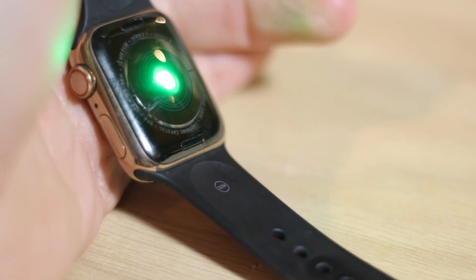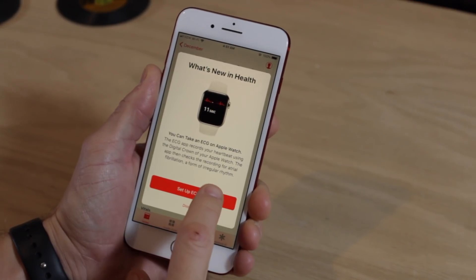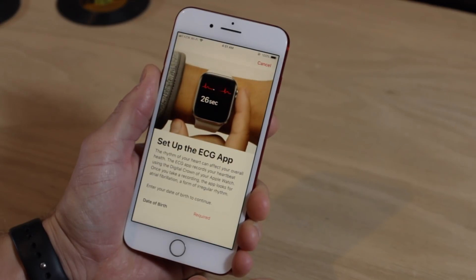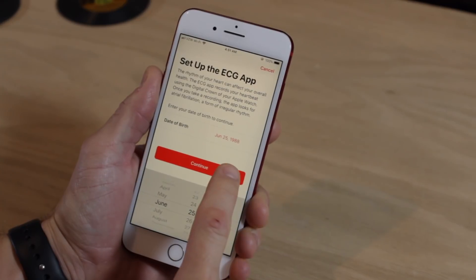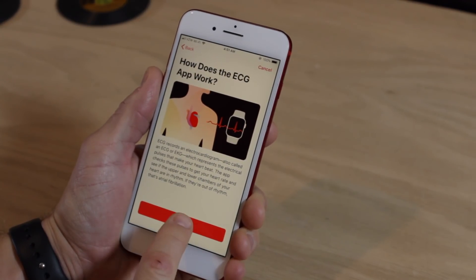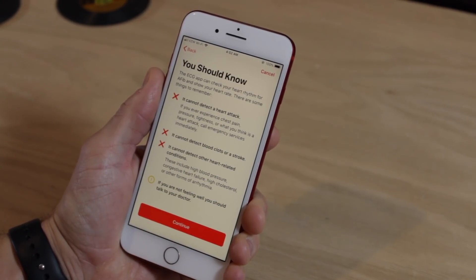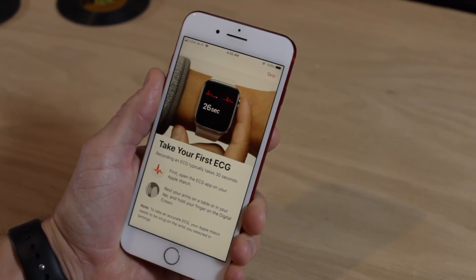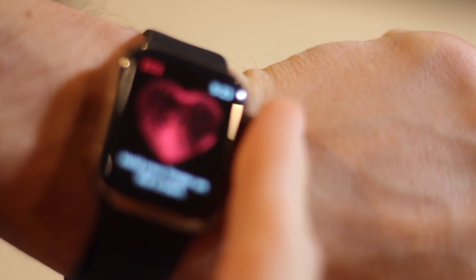To get started with the new feature, open up the Health app on your iPhone, which should be running at least iOS 12.1.1. There you should see a welcome screen to set up the ECG app. From there you may be asked to enter some information, and then you'll see details about what an ECG is, how it works, what the results may mean, and a disclaimer of things the watch can't tell you. From there, head over to your Series 4 watch running at least watchOS 5.1.2 and open the ECG app.